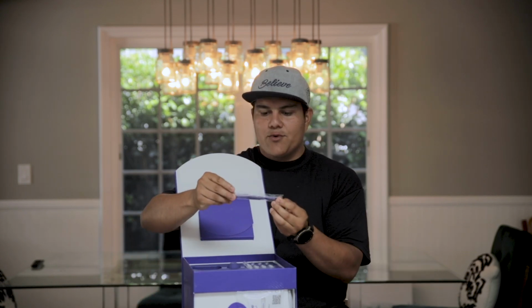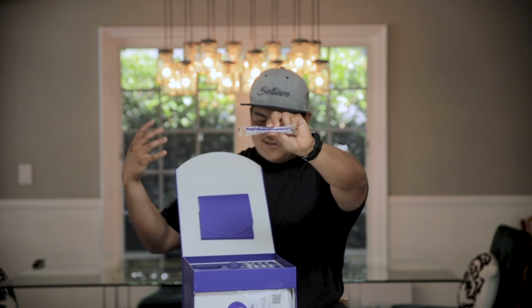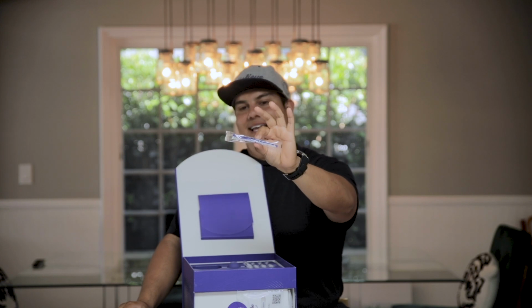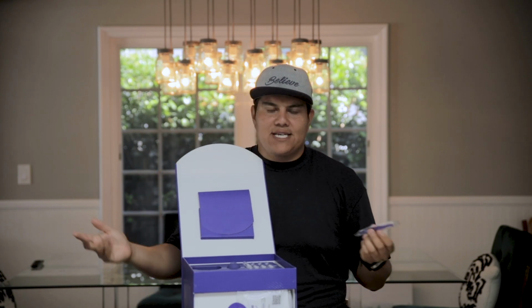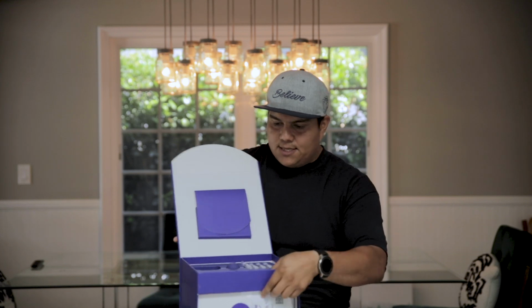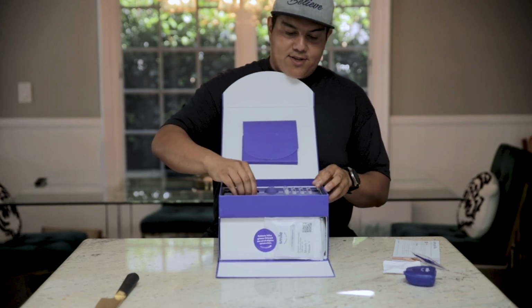It's a little aligner removal thingamabob. Finally, somebody that describes it as a thingamabob. It's supposed to help you remove your aligners. I've seen some people just remove them with their tongue, but if you just can't do that, this is supposed to help you. So there's that right there. And okay, I fixed the angle now. You guys should be able to see it. Sorry in the beginning.